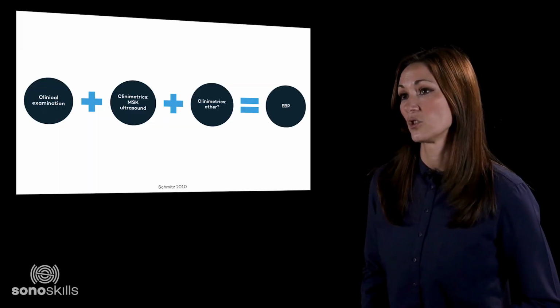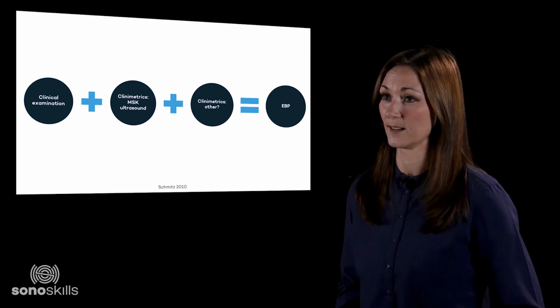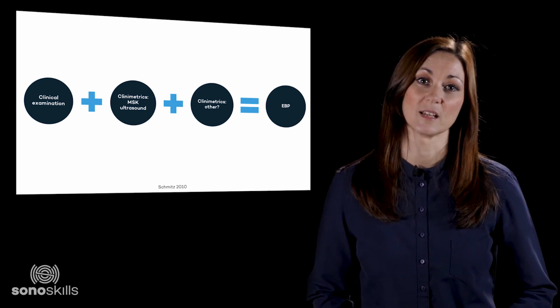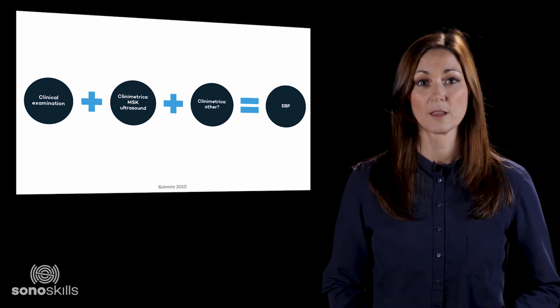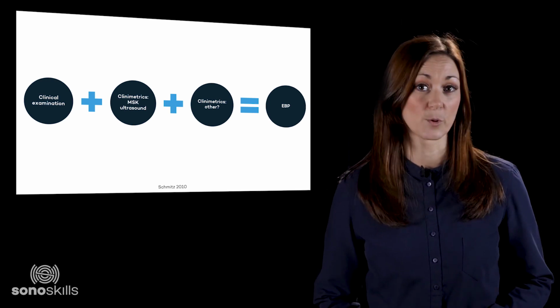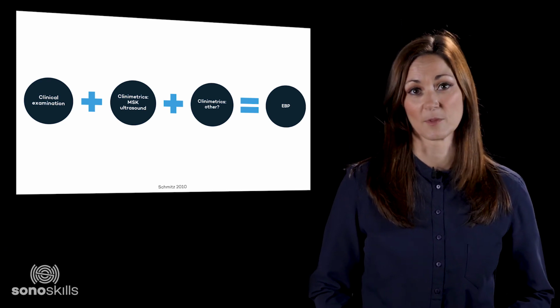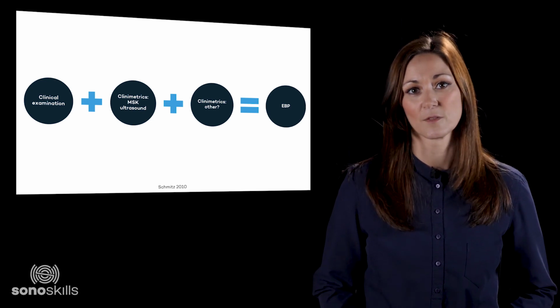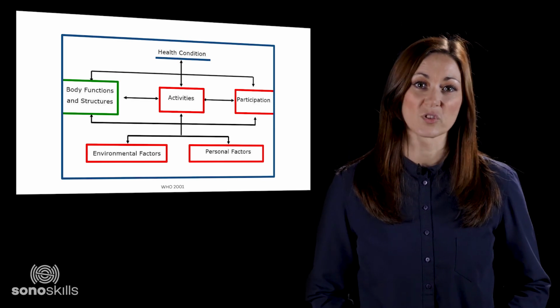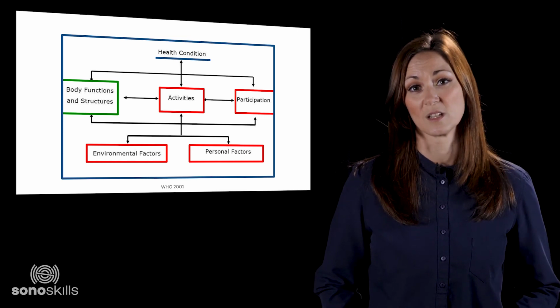In the previous images, you could see how ultrasound is able to demonstrate the specifics of a pathology more so than a clinical examination test could ever show. These specifics are important for your clinical reasoning and your therapy choice. But in theory, all these patients could have been asymptomatic. The findings could have been false positives. So to exclude these false positives, you will have to include your clinical examination tests. These are needed to see if the ultrasound findings are really clinically relevant. And of course, all information from the ICF domain, body functions and body structures should be seen in the broader context.